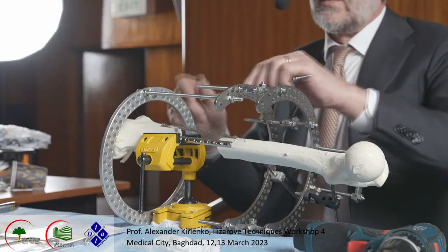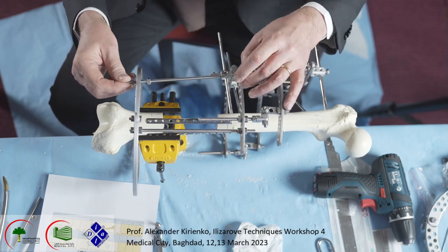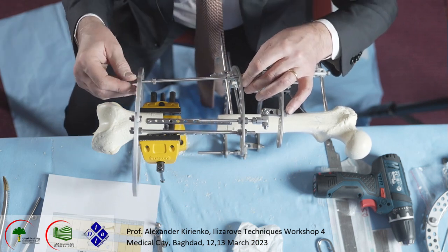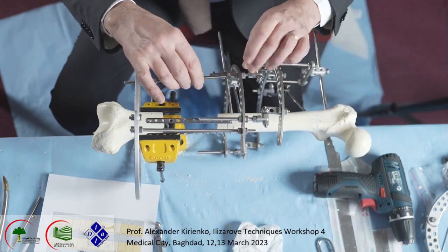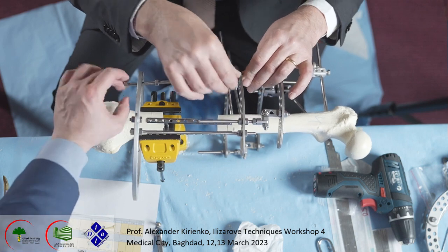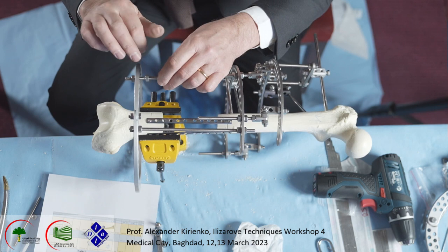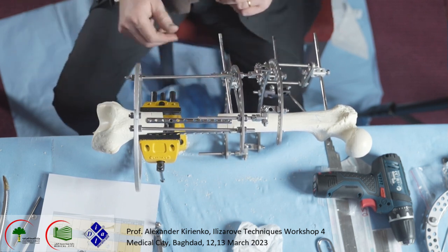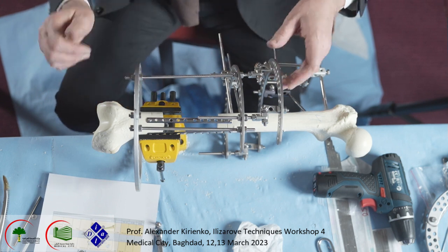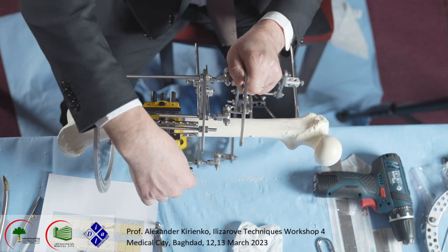I put here. They should be parallel. Just a little bit, attach it, the system here.